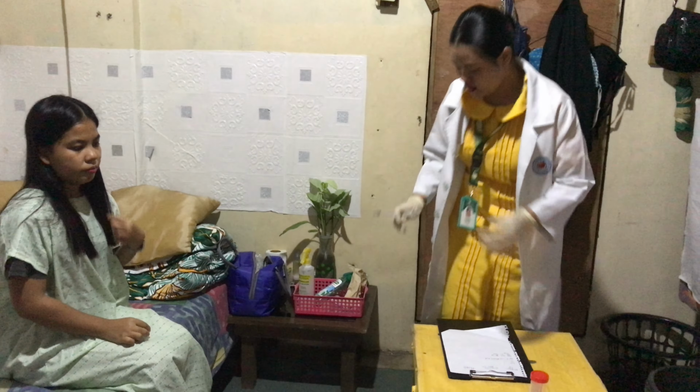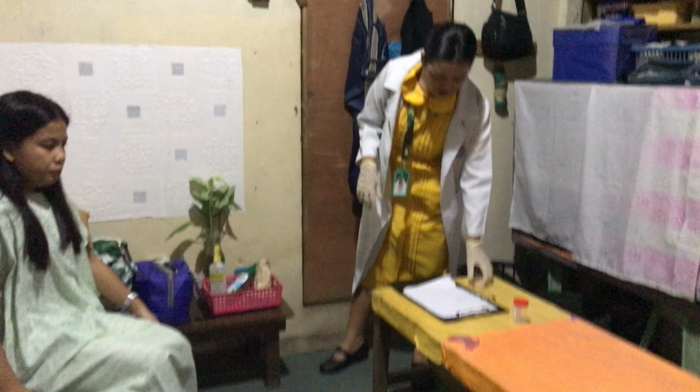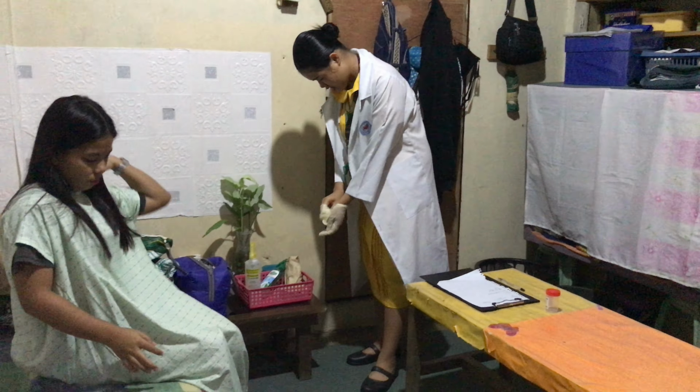so ma'am. Okay, thank you. So okay, we can go now to your room. Okay. Okay, we have here the urine. And then I'll just perform hand hygiene again.